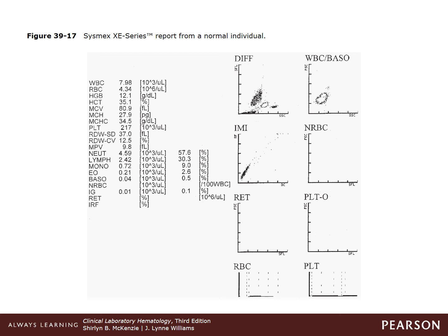So the leukocytes exhibit a stronger fluorescence than the nucleated red blood cells. As the nuclei of these NRBCs are intact, the cells pass through the laser beam of the optical detection block, and they generate forward and side scatter and fluorescence. This information is used to create the NRBC scattergram, which plots fluorescent intensity versus forward scatter.